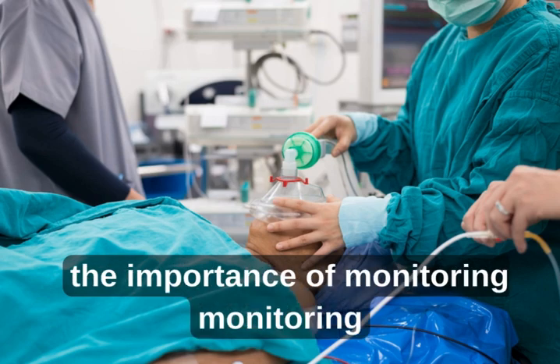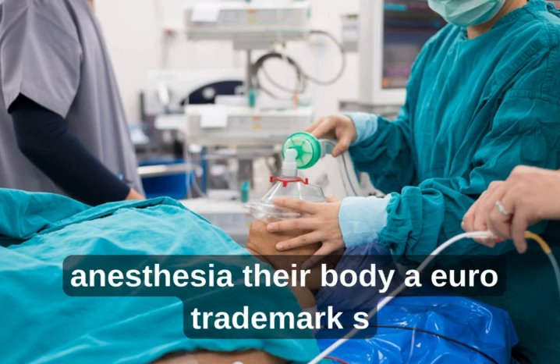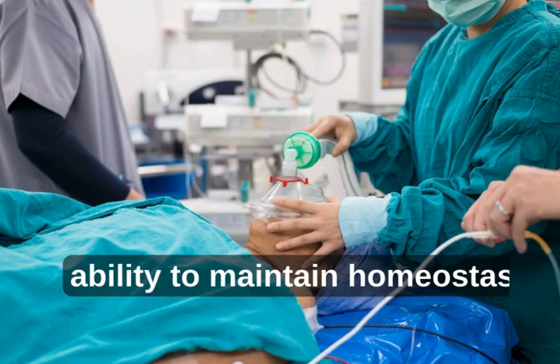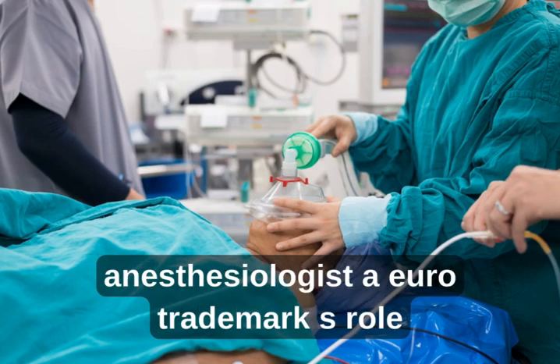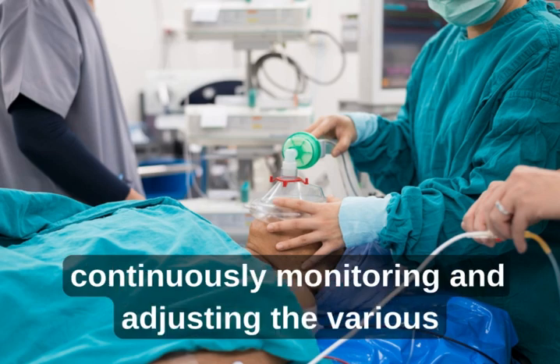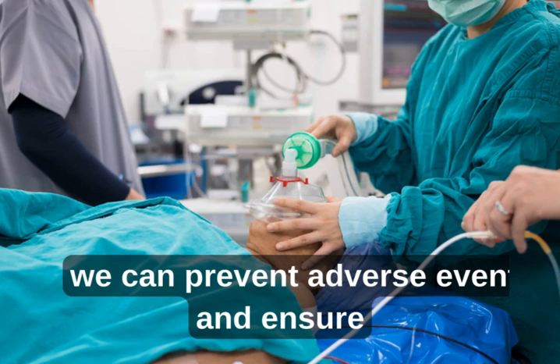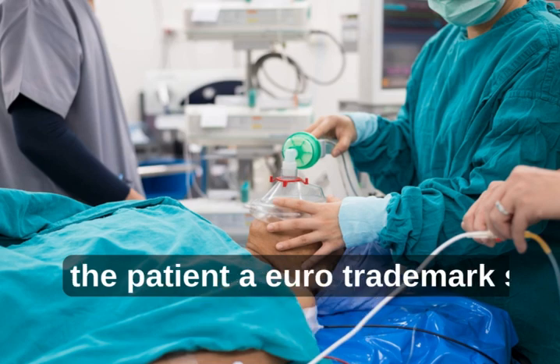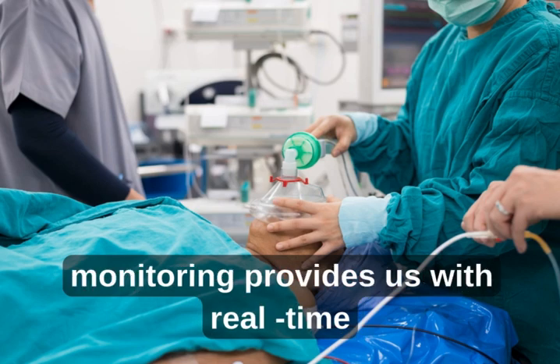The importance of monitoring. When a patient undergoes general anesthesia, their body's ability to maintain homeostasis is altered. This is where the anesthesiologist's role becomes critical. By continuously monitoring and adjusting the various physiological parameters, we can prevent adverse events and ensure the patient's safety throughout the surgical procedure.